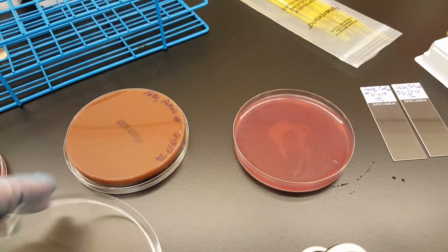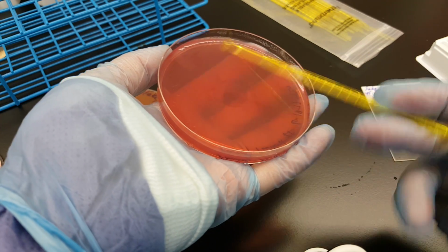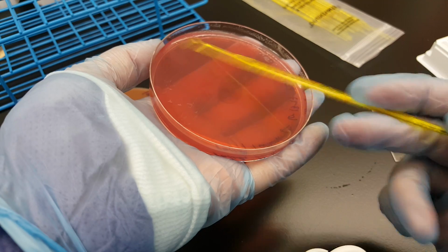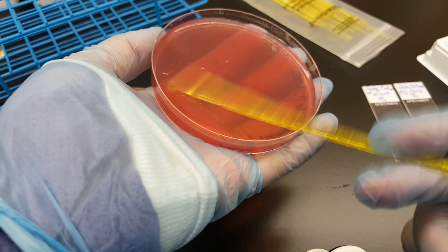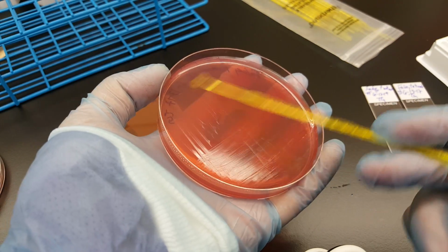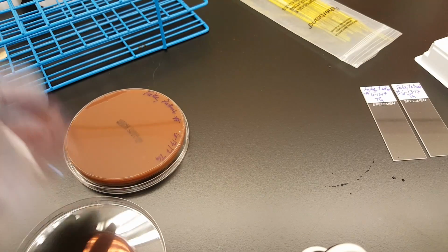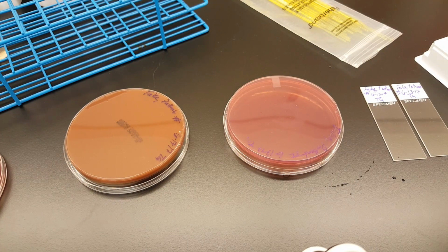And then last but not least, McConkey agar plate, we're going to streak out. It's still kind of wet at that one area. I really want to spread it out. There we go. Go in twice, go in twice, and 1 time. Okay, I'm going to throw my inoculating loop away, and then I'm going to do my smears.